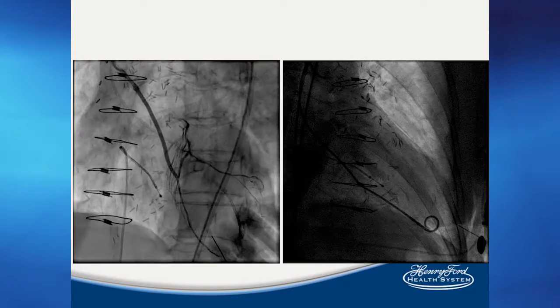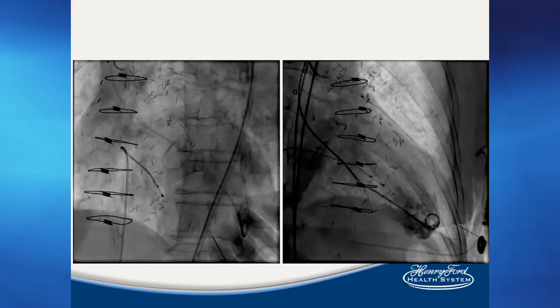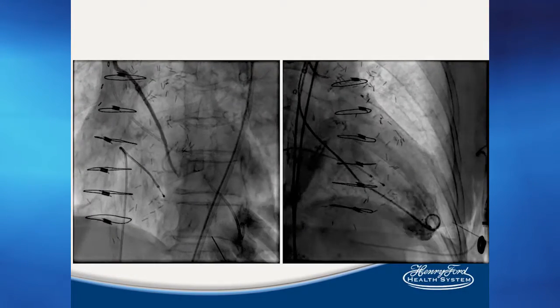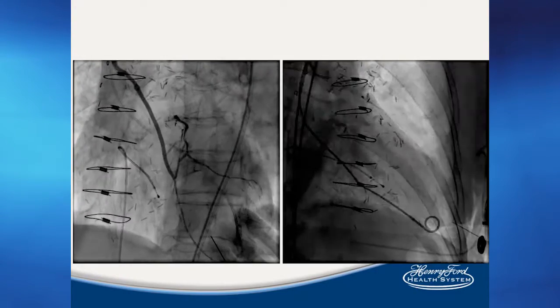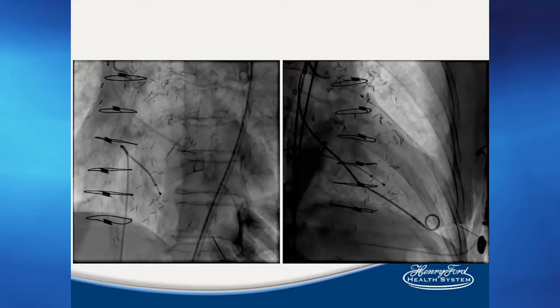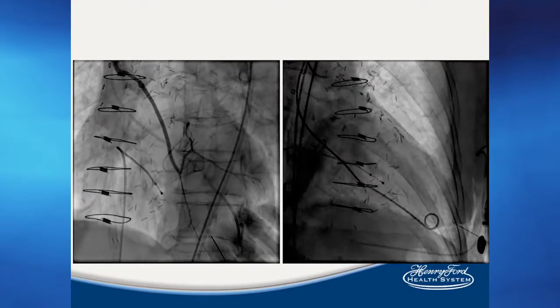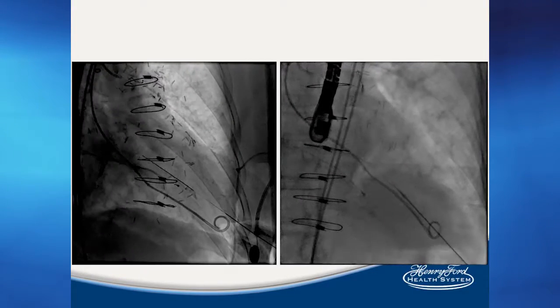Now, I showed you the plan. In that case, we didn't use an apical rail, but in the cases we do, you can successfully cannulate the ventricular apex without doing a big cut down or a thoracotomy and exposure. And what we've done here is we've been able to access the LV apex with a needle. We put a sheath in to prepare us for this.